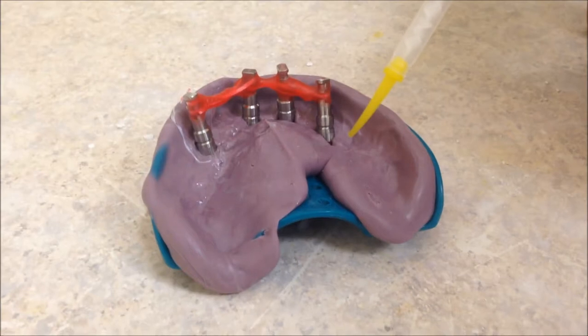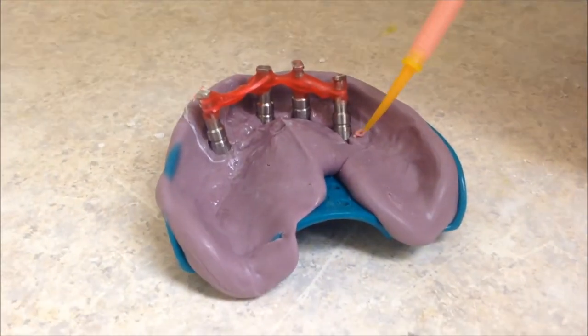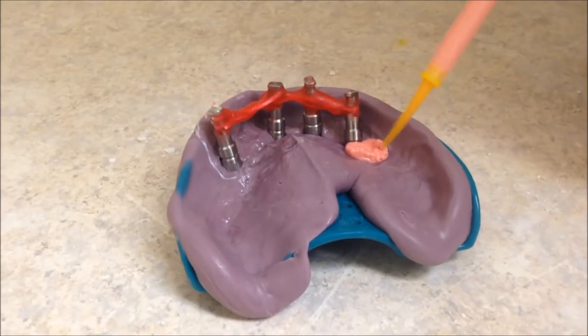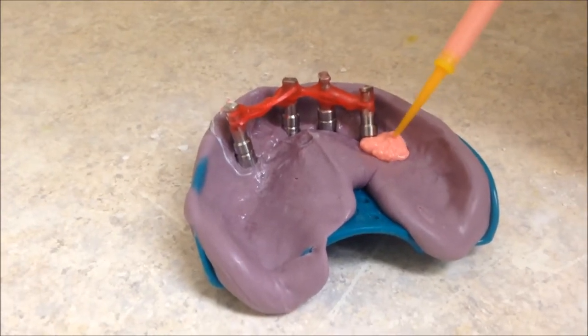After the separating liquid has dried, you can apply the gingival mask material. Make sure to leave plenty of material on the distal of each side of the model so that the overall mask has good structure.